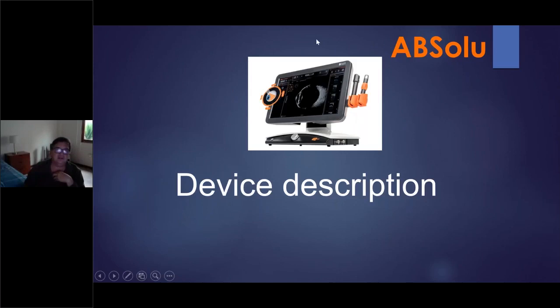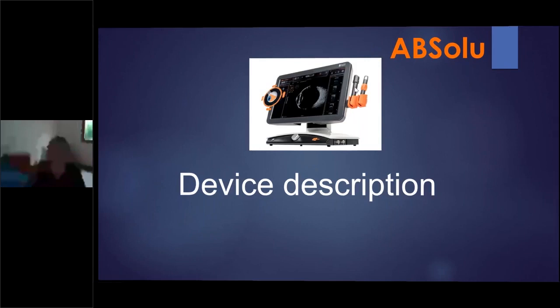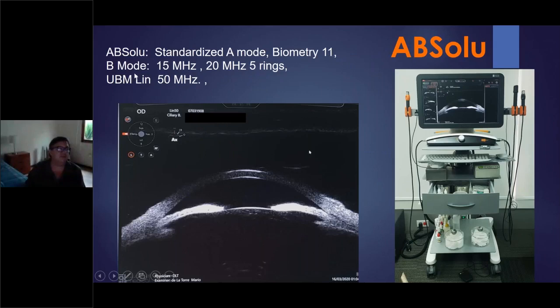This is the first quality, the best quality ecography that I have ever had. Everything, and inside it has the possibility to make UBM. This is the machine that has that. This is absolute standardized A mode biometry at 11 megahertz, B mode 15, and another very interesting probe. This is the 20 megahertz 5-ring. If we have time, I would like to show you some images that I got with this 20 megahertz. And we have the UBM linear 50.